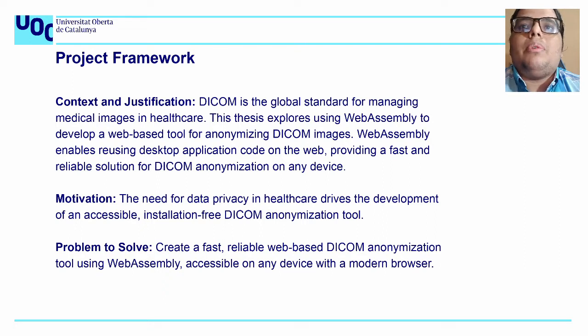WebAssembly basically enables using desktop application code on the web, providing a fast and reliable solution for DICOM anonymization on any device.